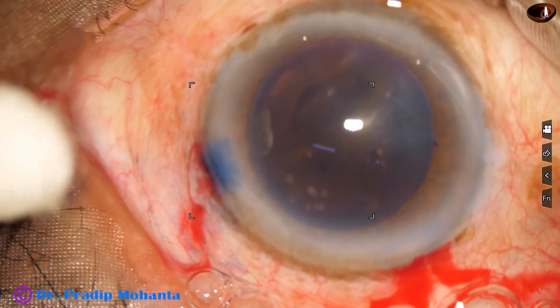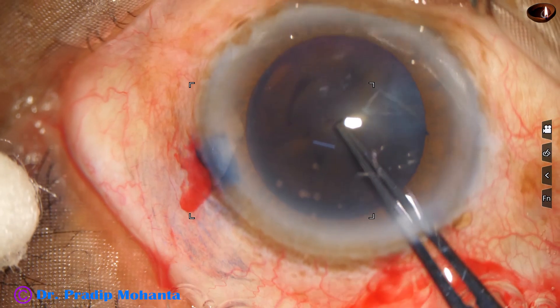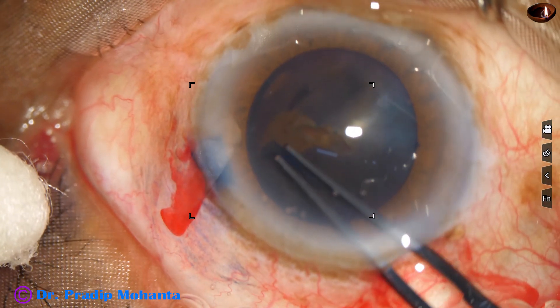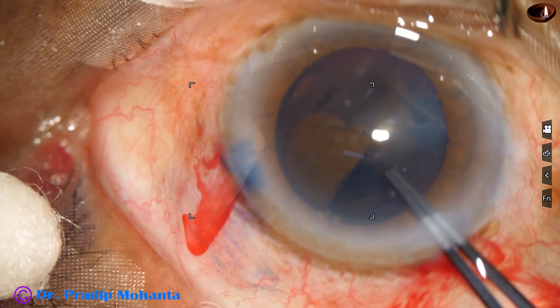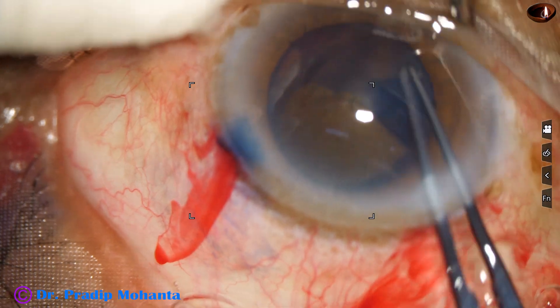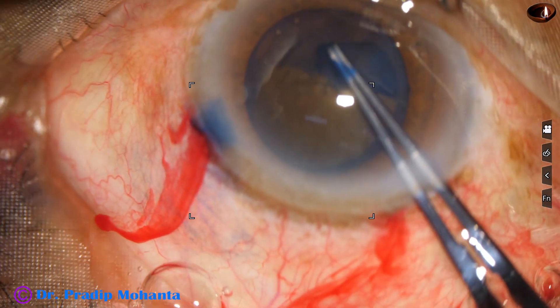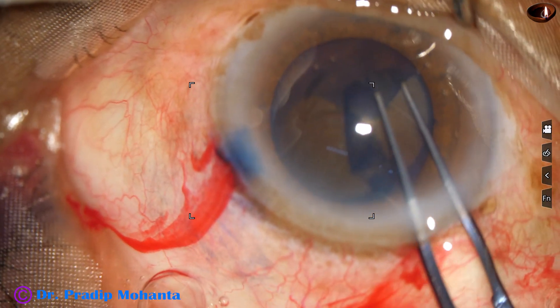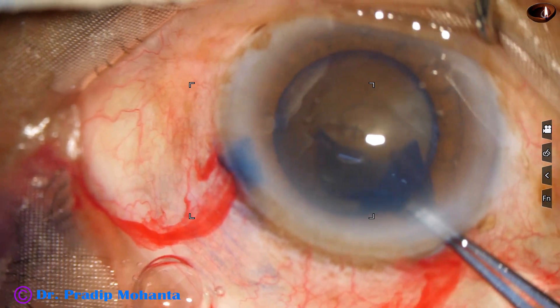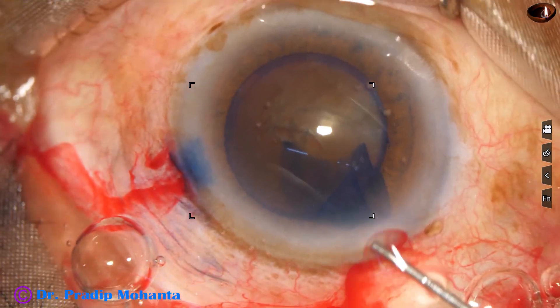And now we are going to do capsulorhexis. This is Utrata forceps. The zonule is a little weak, and to get an adequate sized rhexis I have to go just near the border of the pupil. Then I can get a rhexis of about 5.5 mm. So the size of the pupil is about 6 mm and we have got a rhexis of 5.5 mm.